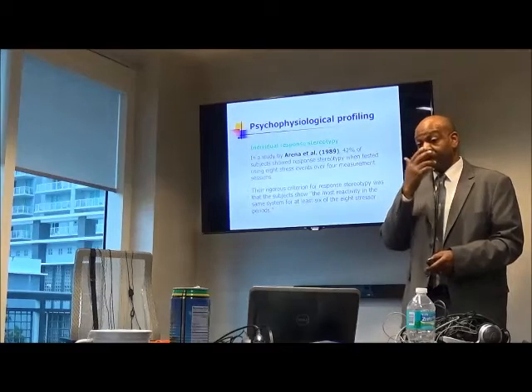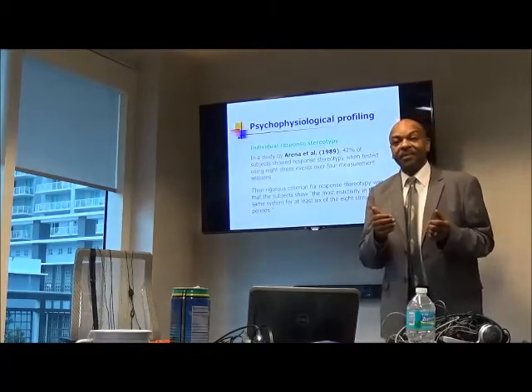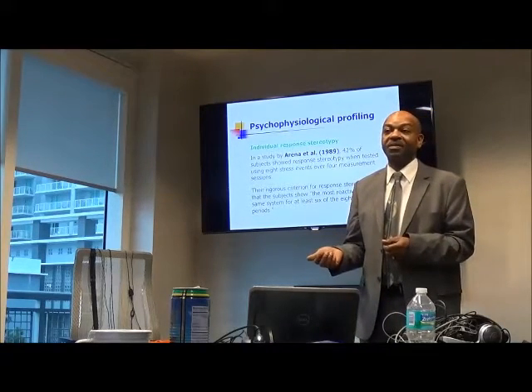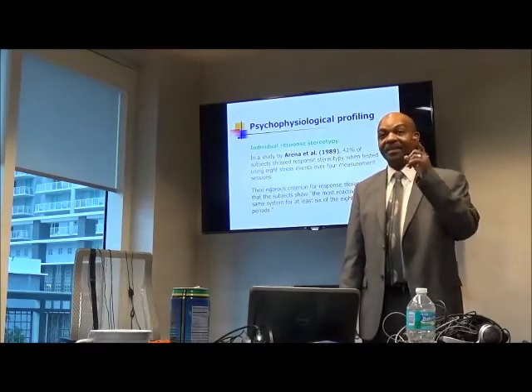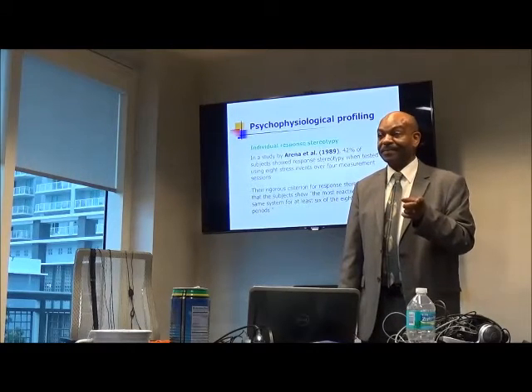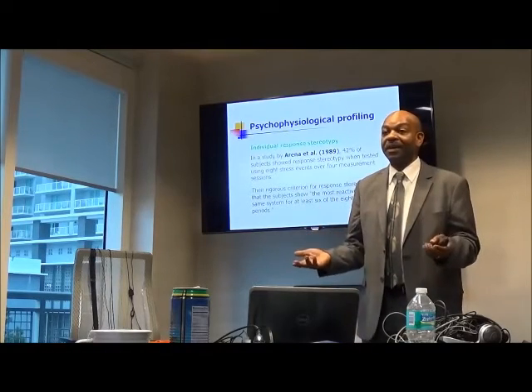For instance, another person that I did a stress assessment with, they didn't have such a response with talking about a stressful event, but the serial sevens, when I asked them to do the subtraction by 7, they didn't get one answer right. And they started crying because it was so stressful for them and embarrassing they couldn't do one.